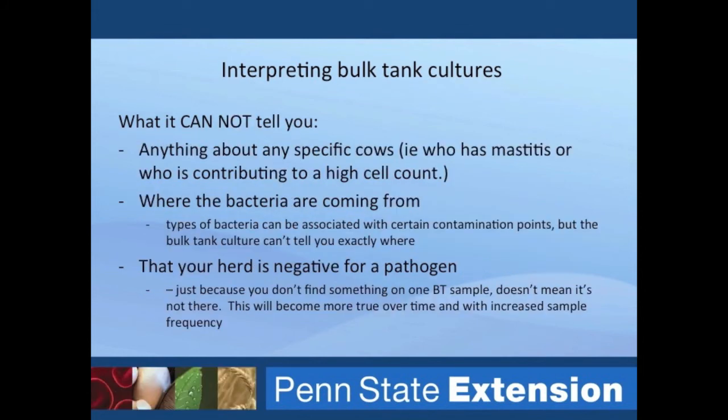Bulk tank culturing can't help you with specific cow mastitis questions. It is not a replacement for individual cow sampling. Cultures are also not able to tell you where the bacteria are coming from. There is research that associates different types of bacteria with different kinds of contamination, but in order to know where the bacteria are coming from in each specific case, changes must be made on the farm and new bulk tank cultures run to see if the numbers have come down.